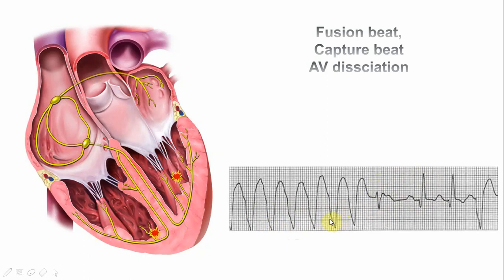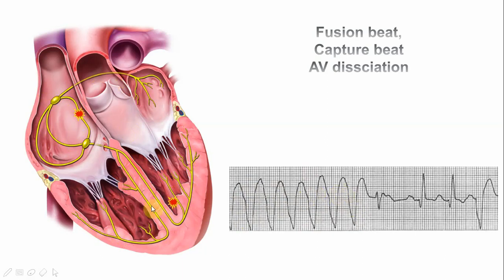These ventricular ectopics are coming at a rate of about 150 beats per minute and have pretty good concordance — we cannot identify a clear R wave or S wave. The classic presentation shows: (1) no relationship between atrial and ventricular activity, (2) possible capture beats, and (3) possible fusion beats. If these are present, this is very diagnostic of ventricular tachycardia.